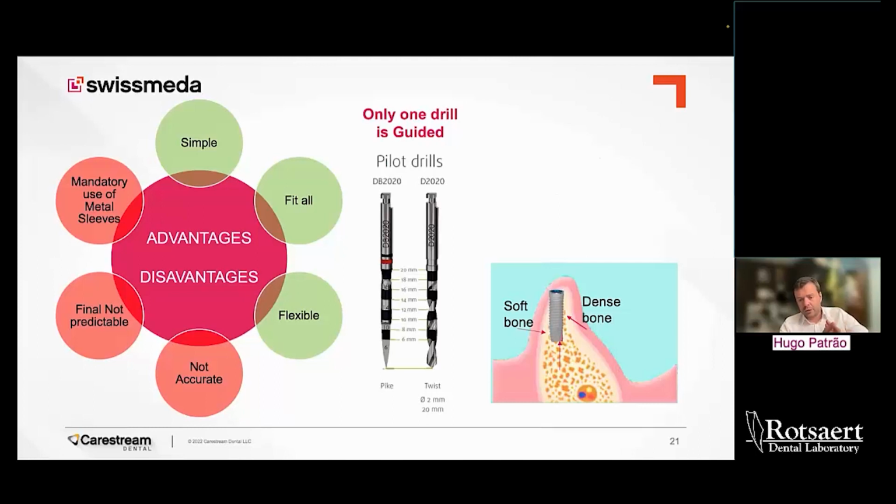So what you would be able to see is that the implant will always create the threads towards the softer bone. In this scenario, I actually only created a simulation of moving the implants bodily. But because you have notches of harder and softer bone in voids, the implant can be moved bodily and angulated out. Now when you look at this, if you start with a pilot drill of 2 mm and place a 4 mm implant, the axis of your implant can actually be 1 mm off. And this is what explains all the difference that we saw a couple of slides ago.